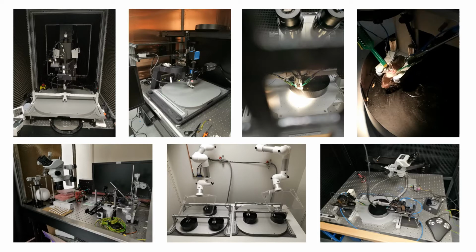Then next, you can see here the setup that allows imaging a whole cortex at the same time at lower magnification than the two-photon, but it allows studying the connectivity between different parts of the cortex, again during the same behavioral experiments. In these pictures you can see that the mouse is head fixed to the frame of the microscopes for electrophysiological recordings and also for the imaging experiments.